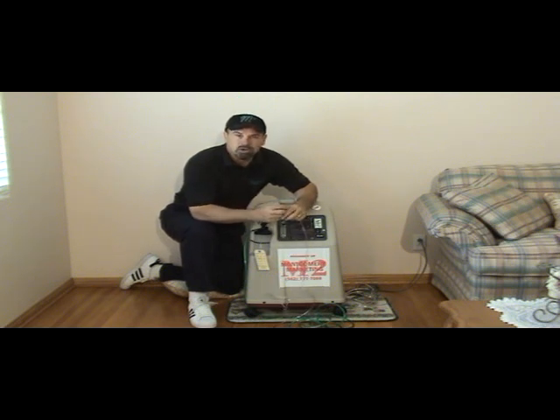One thing I do want to warn you on is I'm going to ask you not to provide extended tubing because of the sound of the unit disturbing the patient. This is a therapy. If you're in an ICU, there are bells and whistles going off all the time, but you wouldn't remove those pieces of equipment from the patient's room. Again, remember, this piece of equipment works best the closest it is to the patient. It's most efficient when you're using it only with the 7 feet of tubing with the nasal cannula or mask.